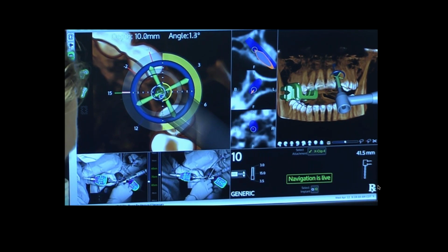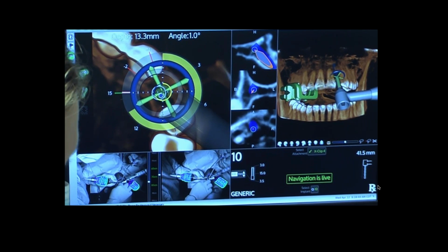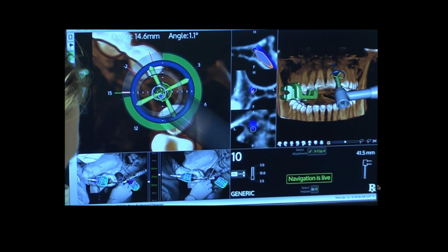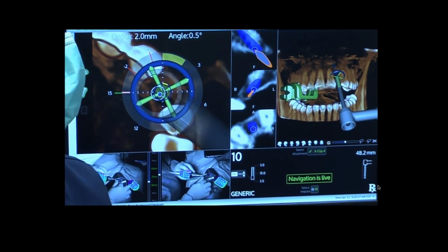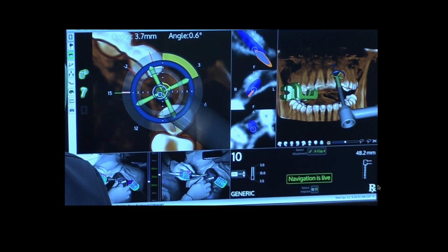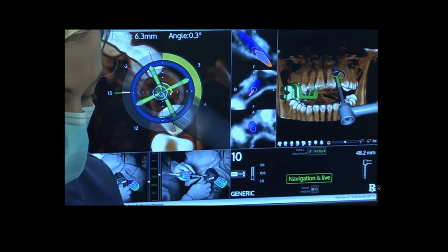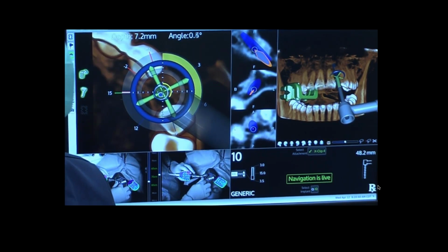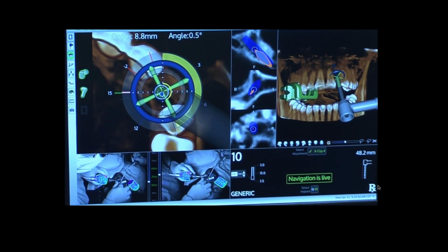And this is very generic, so this is a 3.5 by 15 millimeter implant. And we're just drilling the holes. And you can see, though, I'm very, very careful because there's a sequence of drills that you use. But I'm able to place this implant exactly where he wants it, exactly. And I can do that because of the magnification and the exactness of the system. And I think this would be really hard for me to do accurately freehand. I really think it'd be hard. So, excuse me, I like to do it this way.